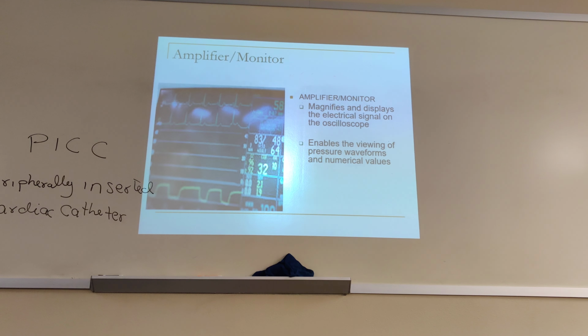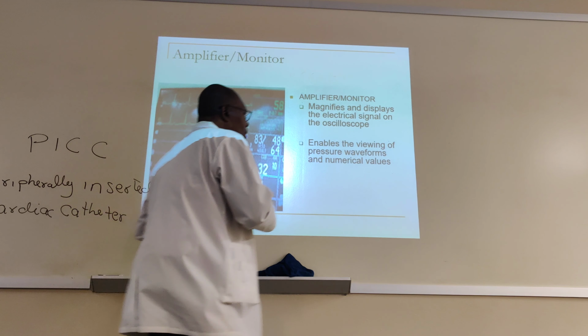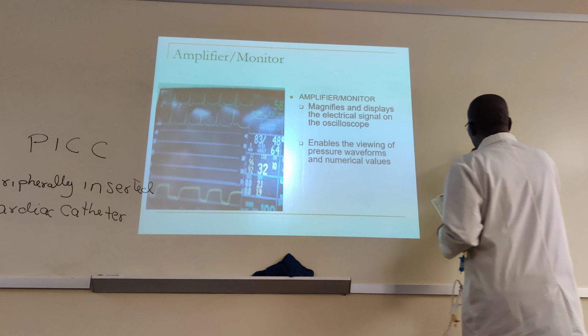So, if I had an A-line inside the patient, then I would have a line there that would look like this. This is what the A-line looks like.